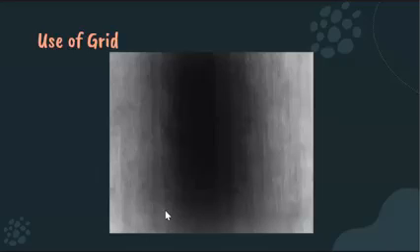Ayan. So, usually when there is grid cutoff, there is production of these lines parallel to how the primary beam was cut off. Okay, so as you can see, there is cutoff here and more exposure in the center because the grid was upside down. Okay, so much more density is produced in the center area of the image if the grid was upside down. Nakabaliktad, baligtad ang pagkalagay ng grid ni RedTech. So it is important to identify the front side and the back side of the grid, most especially those grids that are not parallel. Okay?